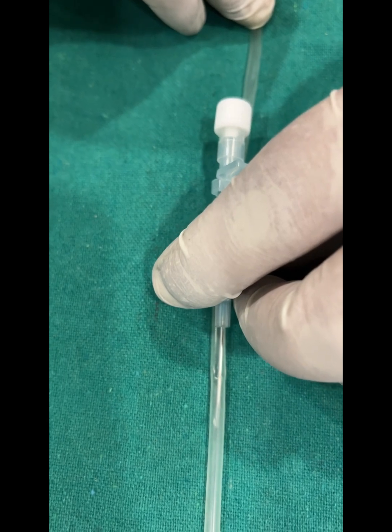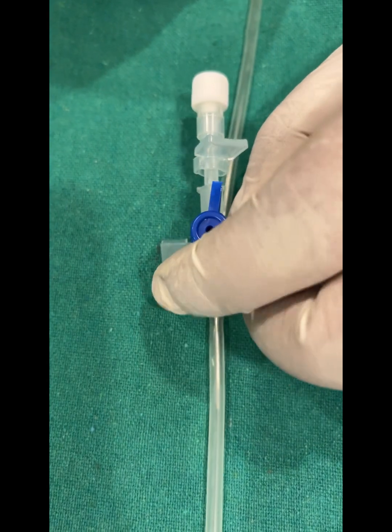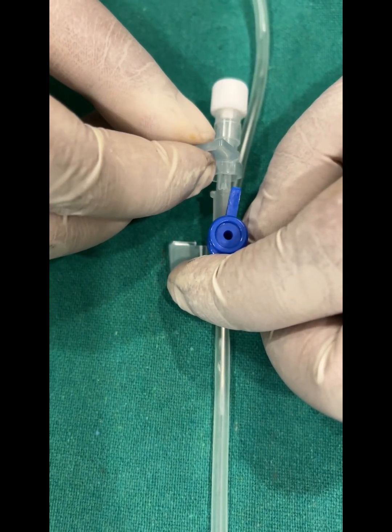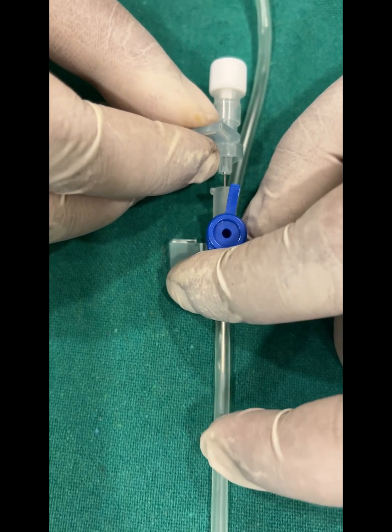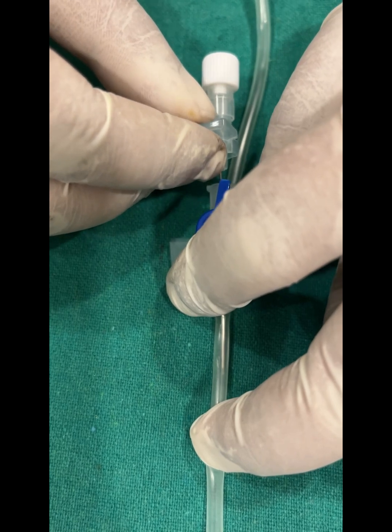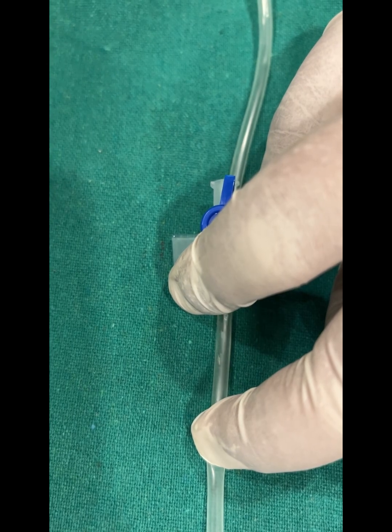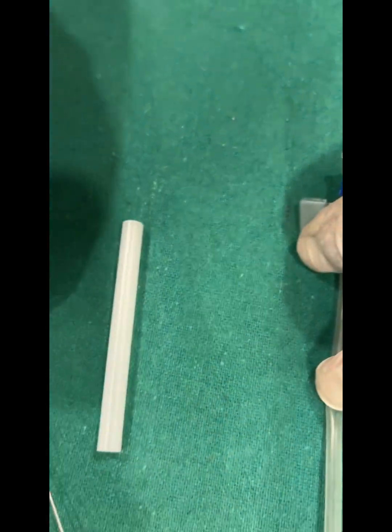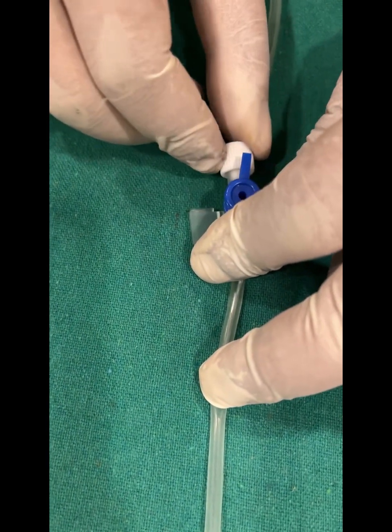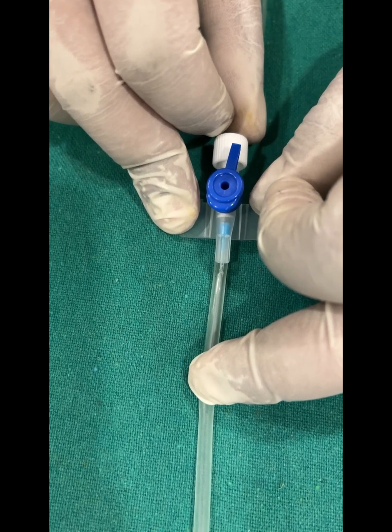We start advancing the cannula, and once it is completely advanced into the vein, we remove the needle. Before removing the needle, we hold the vein to prevent blood flow. We safely remove the needle and use the cap to secure the cannula. For fixation, you can either use a micro port or a cannula fixator.